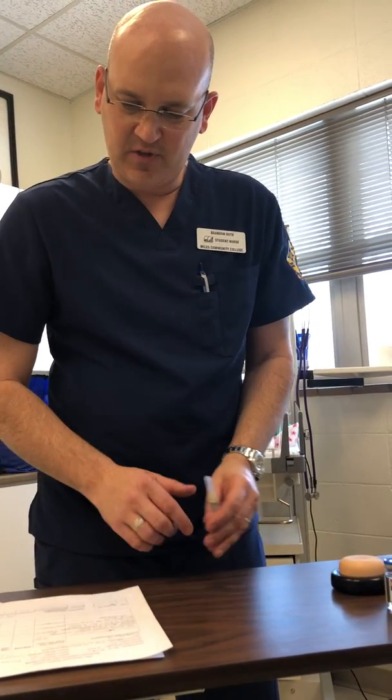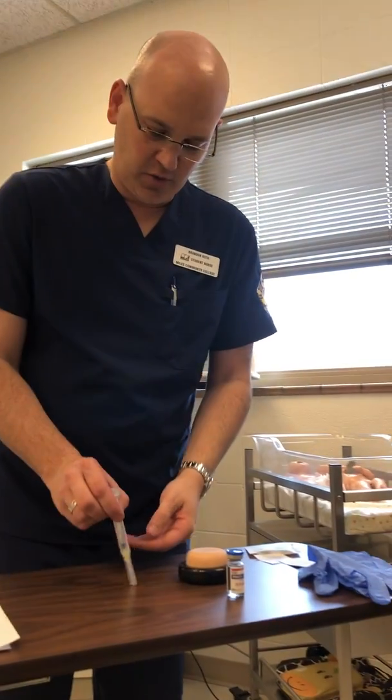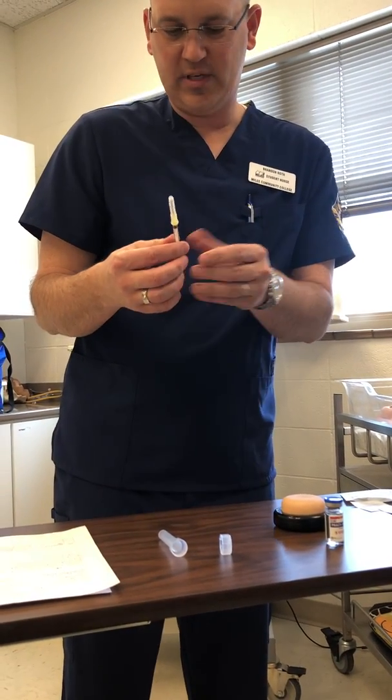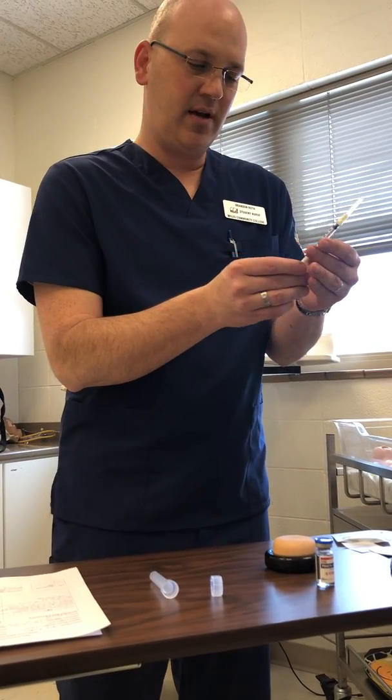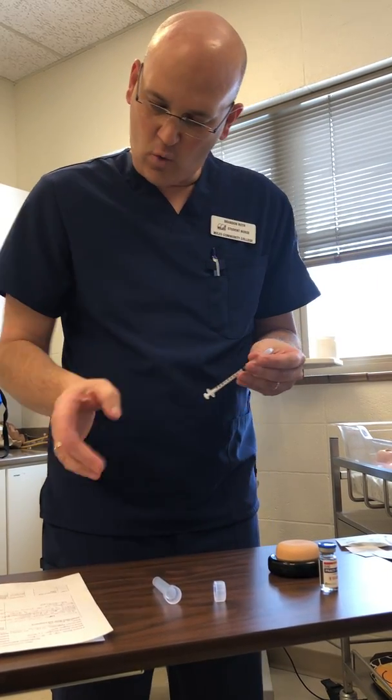milliliters. So now that we have verified that, we're also going to check for patients' allergies, and our patient's only allergy is Celebrex. So now we are going to prepare for the injection. We are using a measured syringe that are in 10th milliliters. Our order is for 0.1.